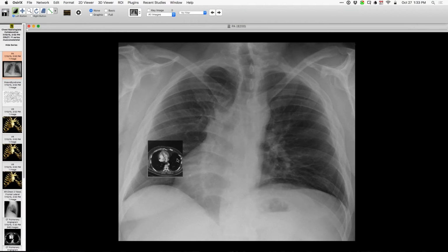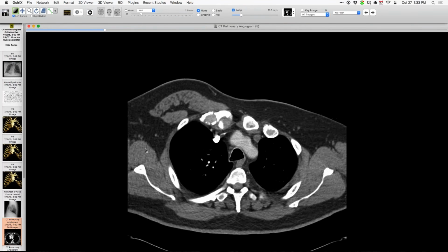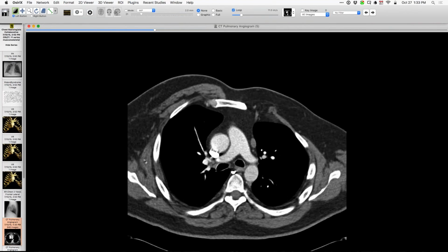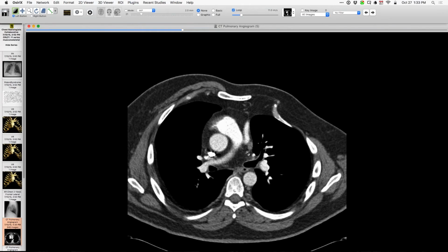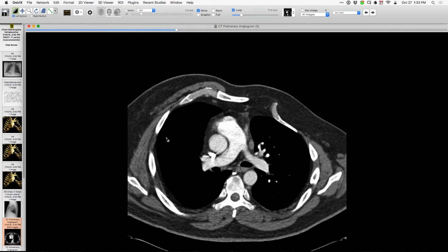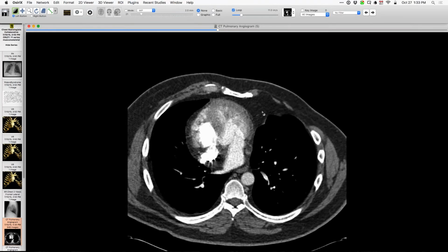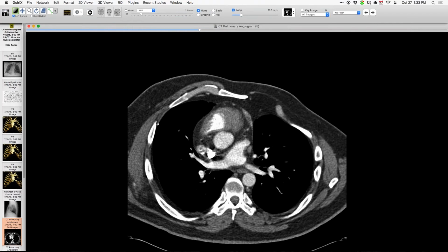Here I'll bring in the CT to show you the absence of the pectoralis muscles, very striking. The chest happens to have a persistent left superior vena cava. But this is the first case I've seen, and I did look it up subsequently, in which some costal cartilages are absent. So you can see that here. And I did find case reports of that.